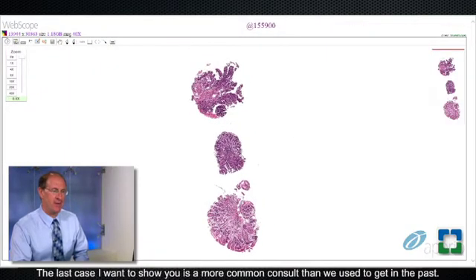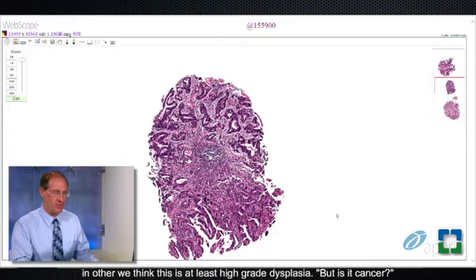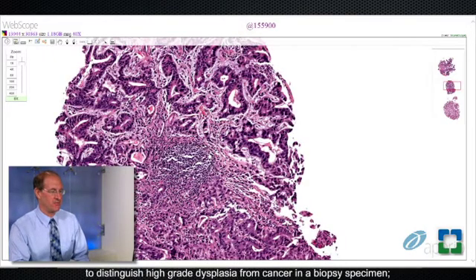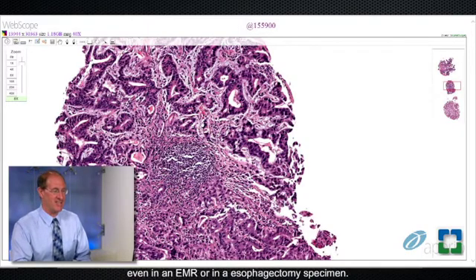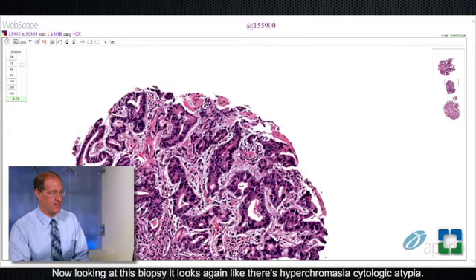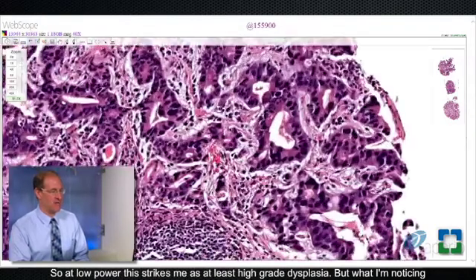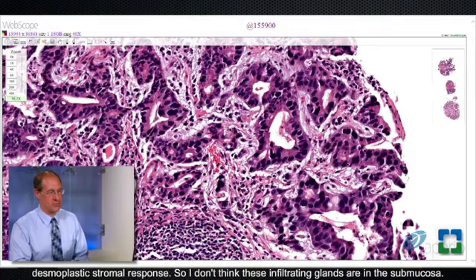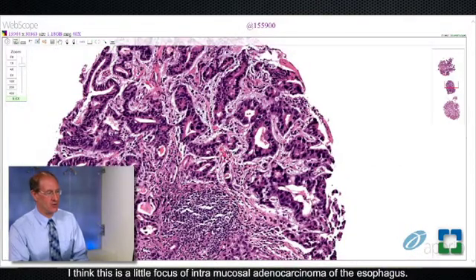The last case is one we get increasingly often — a pathologist sent us this case saying they know it's bad, at least high-grade dysplasia, but is it cancer? It can be quite difficult to distinguish high-grade dysplasia from cancer in a biopsy specimen, and on occasion it's difficult even in an EMR or esophagectomy specimen. Looking at this biopsy, there is hyperchromasia and cytologic atypia not only in the glands but also on the surface epithelium. At low power this strikes me as at least high-grade dysplasia. At high power I'm noticing irregularly-shaped, infiltrative glands into the lamina propria, but they're not associated with a desmoplastic stromal response. I think this is a little focus of intramucosal adenocarcinoma of the esophagus.